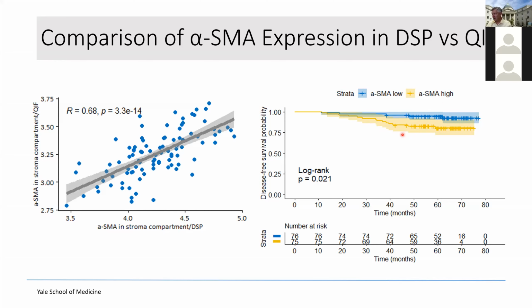So it's hard to find patient cohort tissues that are treated with trastuzumab. And in fact, I understand Karolinska has one. So we'll be coming and knocking on your door shortly to do this assay on your cohort, or perhaps you want to do it because it's so easy to do. We all do alpha SMA in our labs to identify different kinds of sarcomas or to look for myoepithelial cells. And this is just regular old alpha SMA, the same one that we use in our routine immunohistochemistry labs.